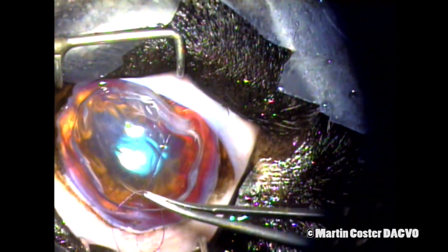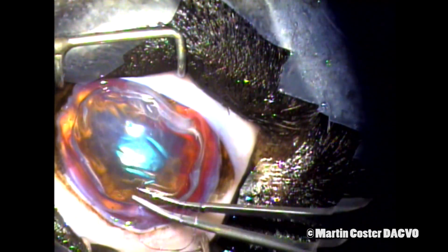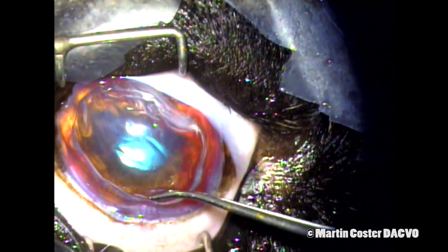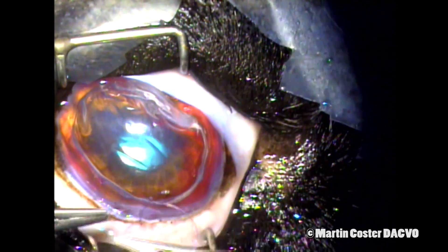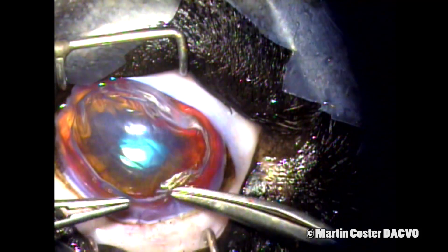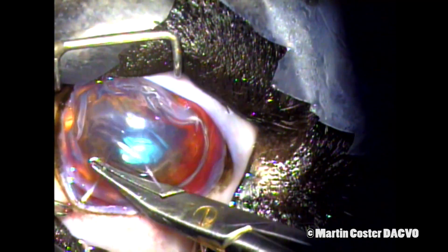I then start the corneal closure using that same 8-0 Vicryl — the stay suture in the center of the cornea. I like to place three cardinal sutures along the incision to help keep the cornea opposed appropriately so that we don't end up with an overlapping section as we close the entirety of the cornea later on. Much of the suturing again has been sped up for brevity. Here's the second cardinal suture.